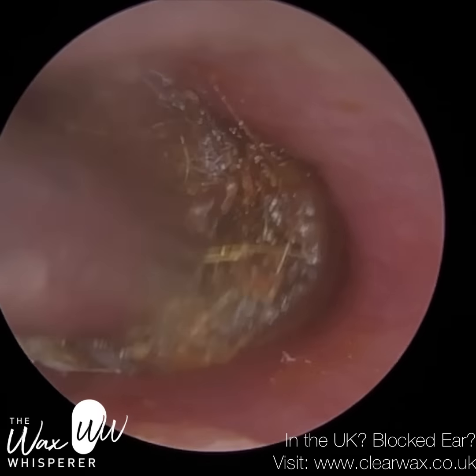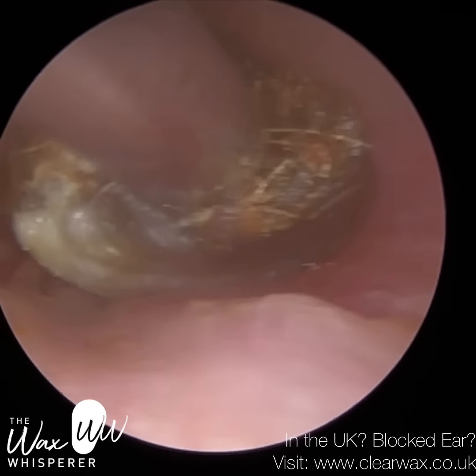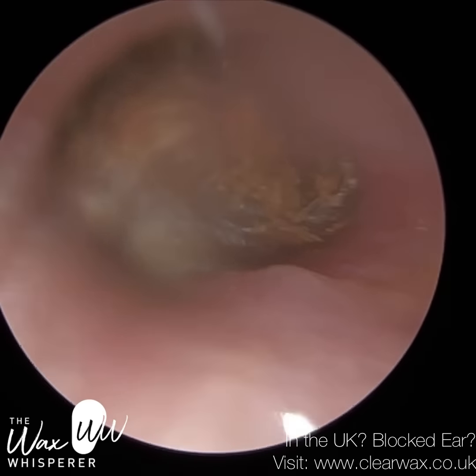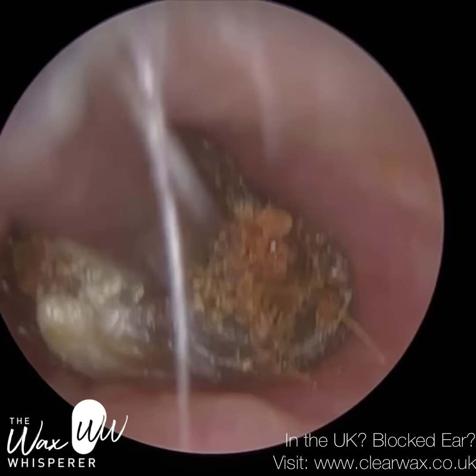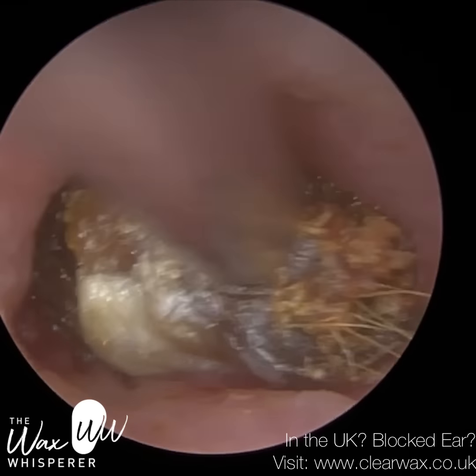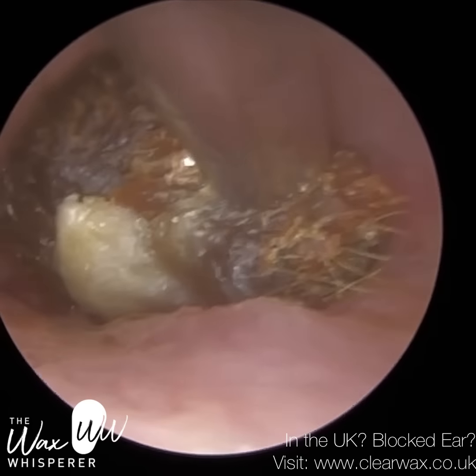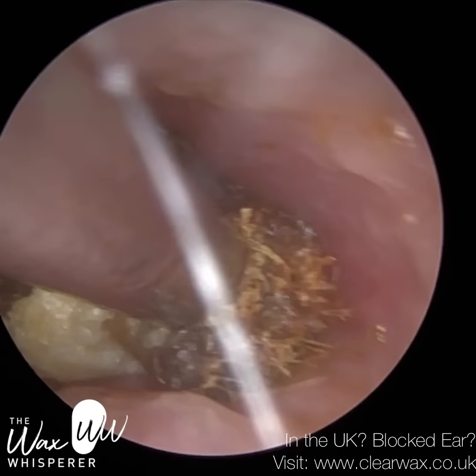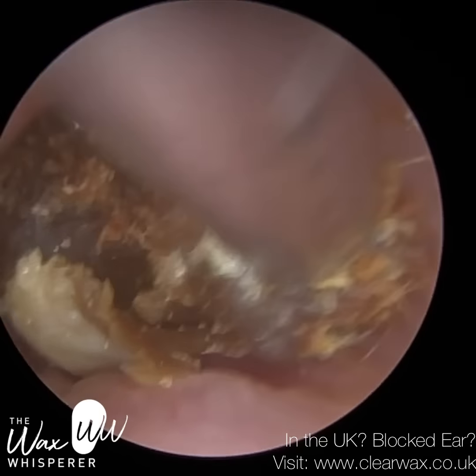And I've more or less loosened the plug all the way around the southern hemisphere, but it's still attached at the roof, but I just can't get access to that because it's upwards. There's a widening there, and the canal wall obviously in front of it is preventing me to go up there, but I'm going to give it another go in a minute. I'm just angling upwards, and I'm just trying to tease it forwards. You can see here, as I'm bringing it forwards, the narrow part of the ear canal is trapped at the bottom. So I'm just trying to wriggle this, and I'm going to lift it up and over that a bit later. In fact, I think this tears off this bit.